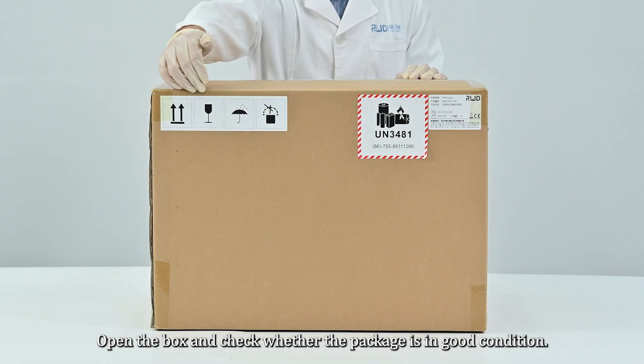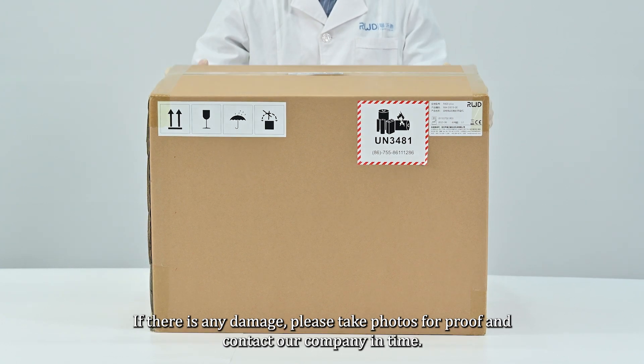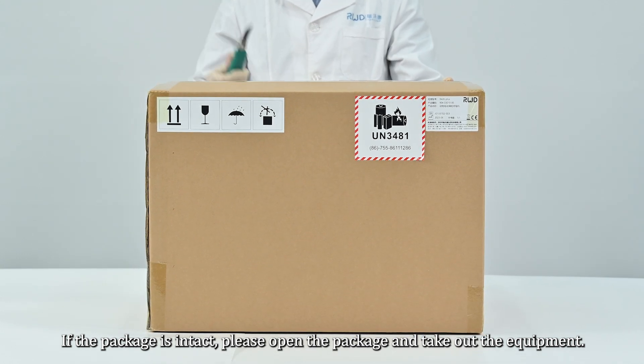Open the box and check whether the package is in good condition. If there is any damage, please take photos for proof and contact our company in time. If the package is intact, please open the package and take out the equipment. If you have any questions or need help, please contact us for support.